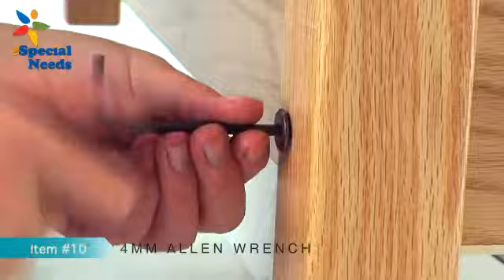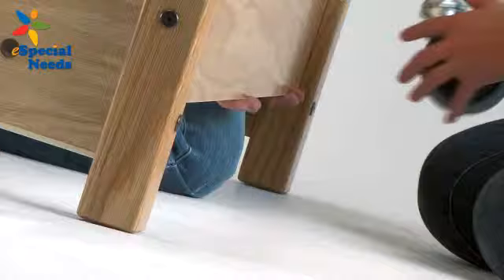Step 2. Install the headboard and footboard to the side panels using the 12 long allen bolts provided. The headboard and footboard will be elevated off the floor when installed. Tighten the allen bolts using the 4mm allen wrench, item number 10, provided in your hardware kit. Now check the alignment of the decking on the electric frame at the headboard and footboard ends. Even up the spacing and tighten the 8 hex bolts connecting the side panels to the frame installed during step 1.